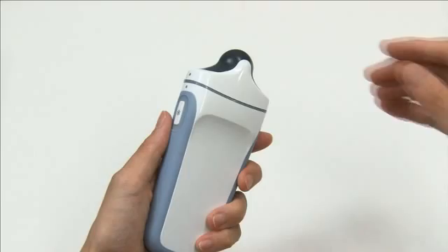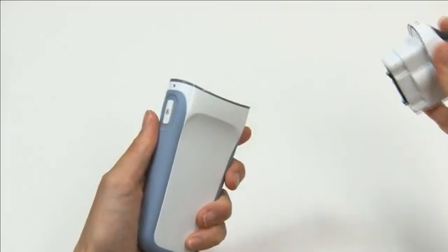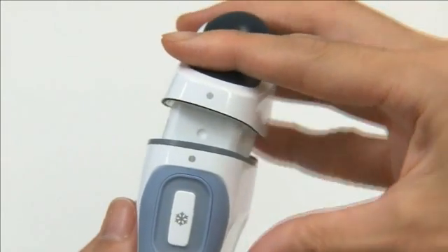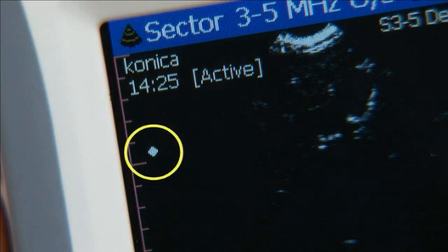The transducer is attached to the probe by pushing it in. To release the transducer, pull it out. To assemble, insert the transducer so that the two silver dots appear on the same side.